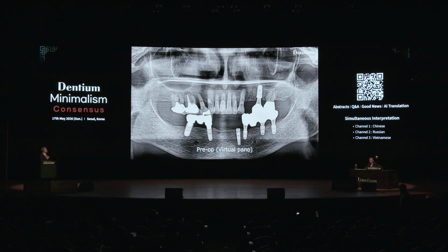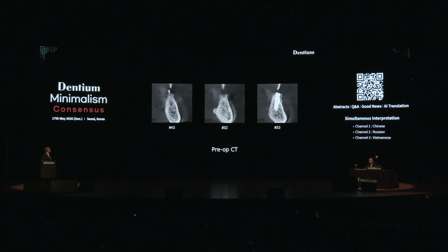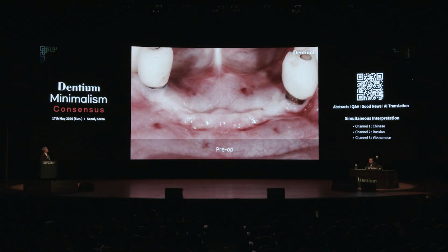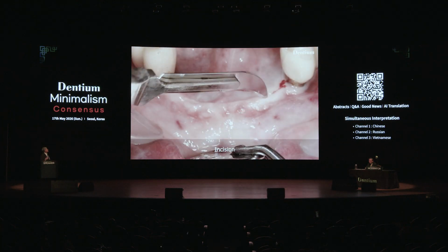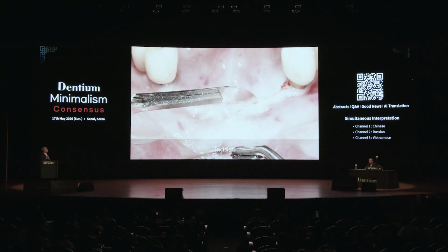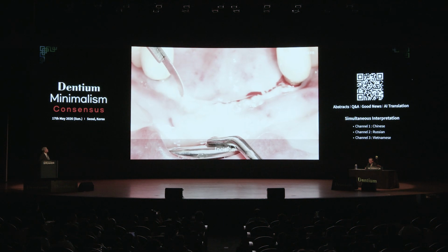So this is a video of the concept of the narrow diameter implant in the anterior mandibular area. Very similarly, we made a crestal incision in the keratinized zone area.